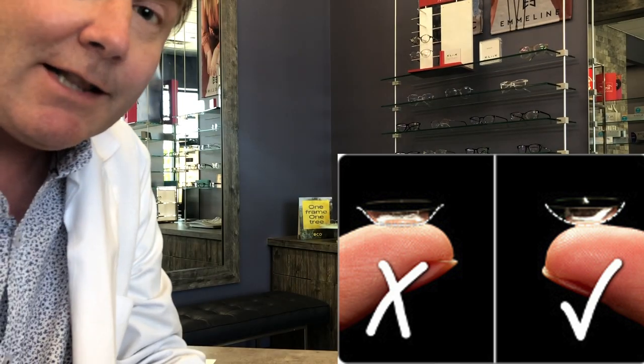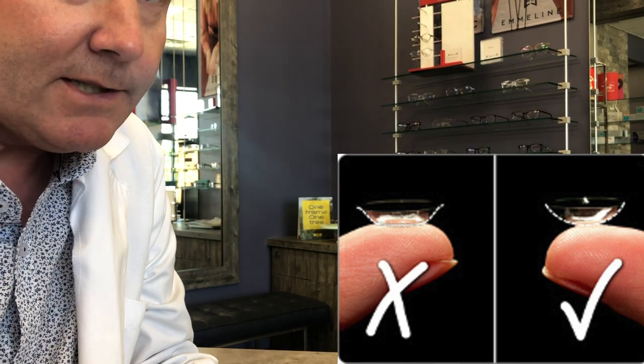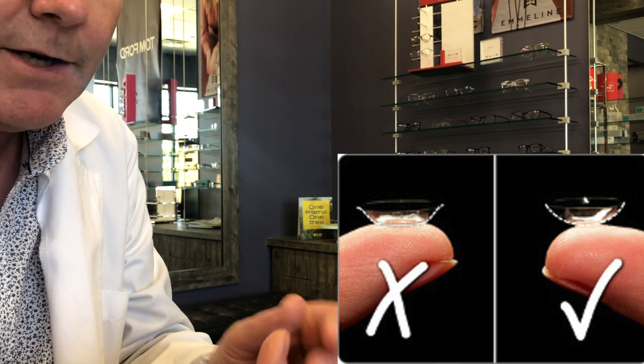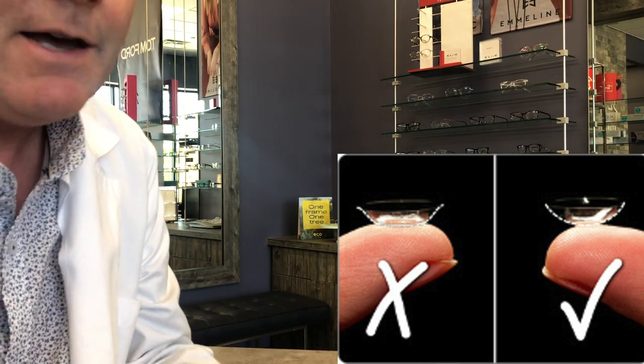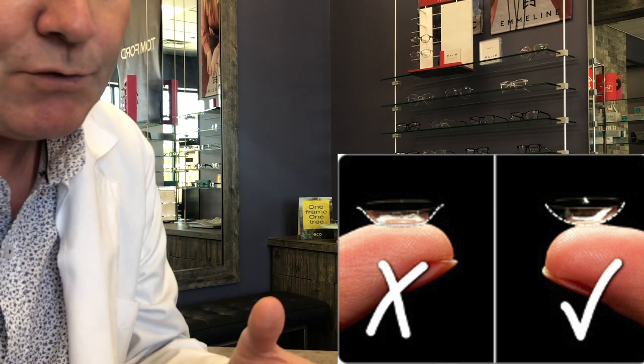If you put the contact lens inside out it's not necessarily going to harm your eyes, but it's not going to feel as comfortable and your vision won't be as clear. So if you notice the lens doesn't feel quite as comfortable, you might want to take it out and check if it's right-side out before putting it back in.